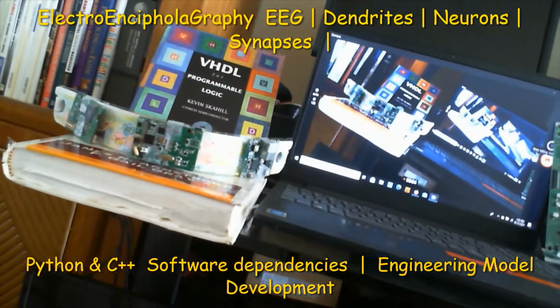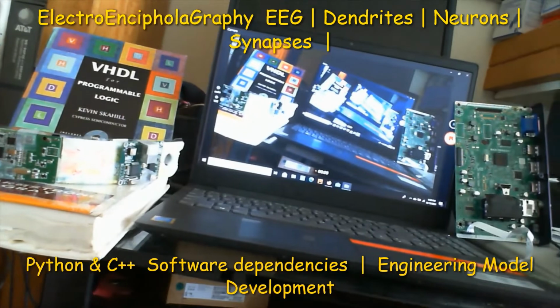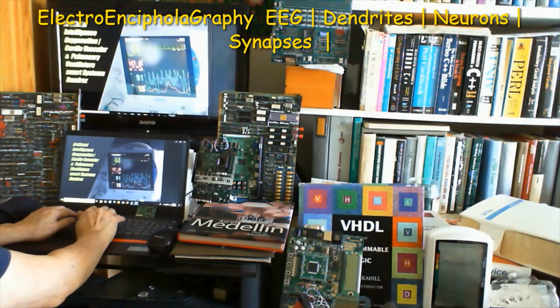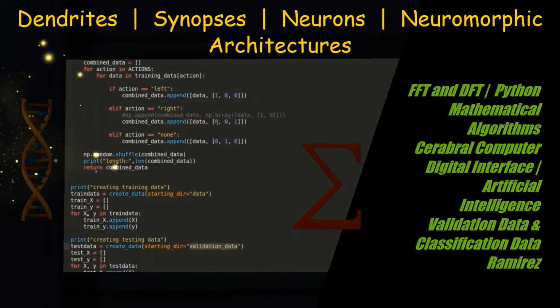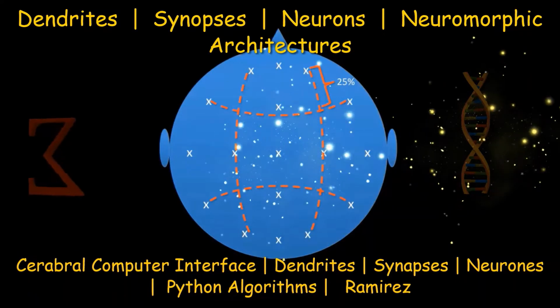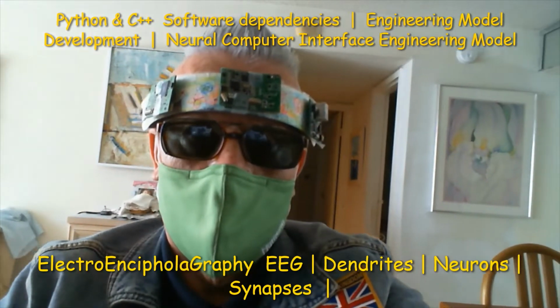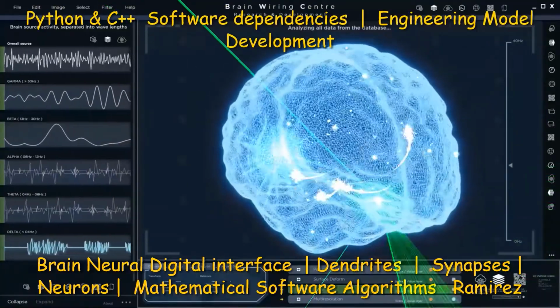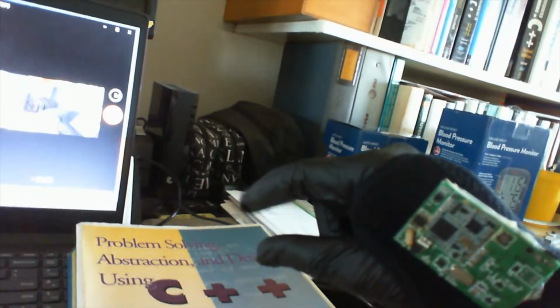Electroencephalography is a paradigm utilized to measure the electrical activity of the human brain. In this application, I show various electrodes commonly placed on the scalp of a human being, first, in order to detect the electrical activity of neurons in the cerebral cortex.